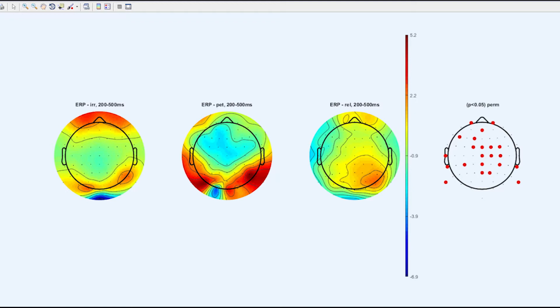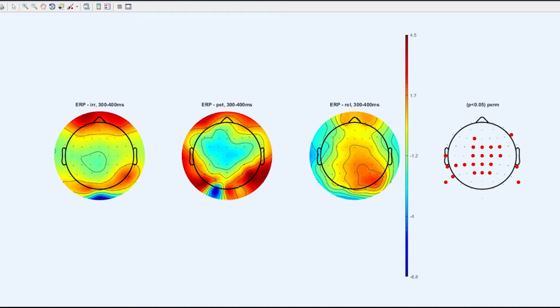The topographies can show us where in the brain is more positively or negatively active during times throughout the different stimuli. For example, here we can see that the parietal areas are much more positive during the oddball stimulus than a relevant and irrelevant stimulus. It is particularly interesting to see that the brain during the oddball stimulus gave much more positive recordings at the time a P3 usually occurs, especially in the parietal areas, than the relevant and irrelevant stimulus conditions.